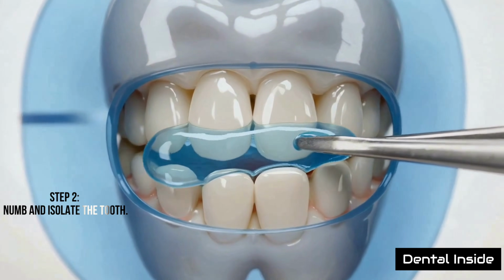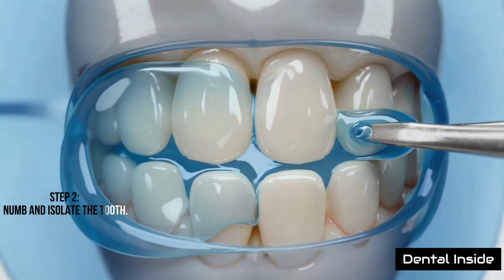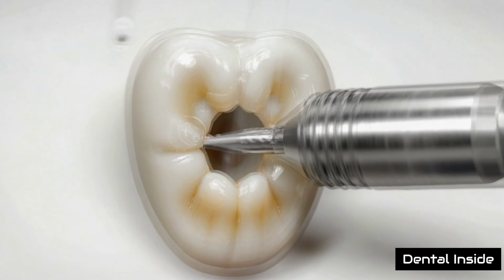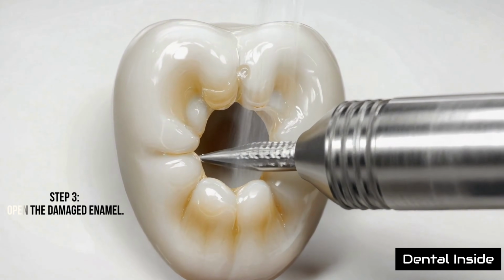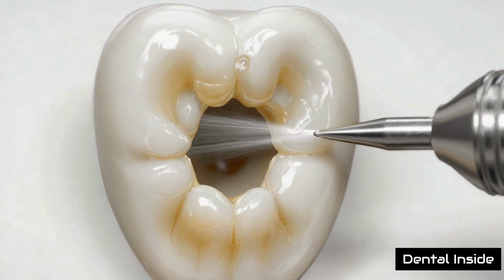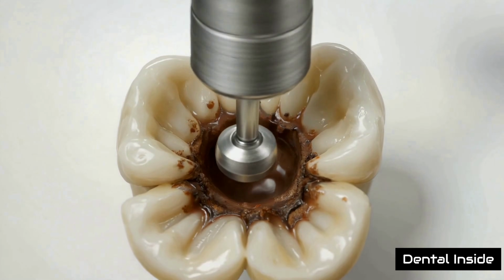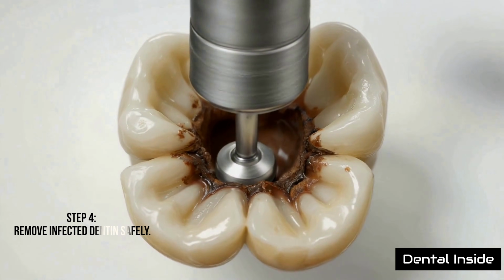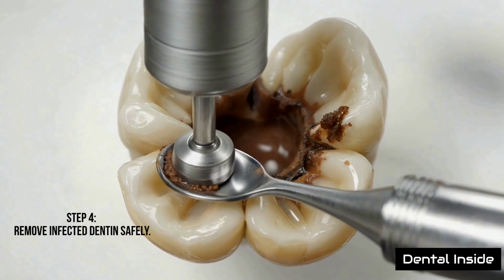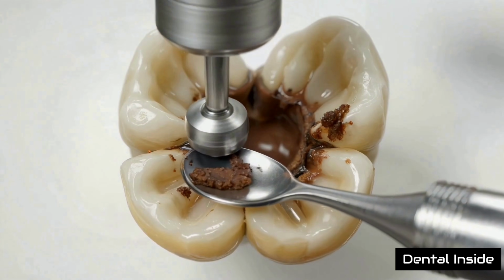Before treatment, the area is usually numbed and isolated so the tooth stays dry and comfortable. The dentist opens the damaged area carefully, removing weak enamel to reach the infected dentin. Soft, infected dentin is removed in controlled layers, while as much healthy tooth structure as possible is preserved.